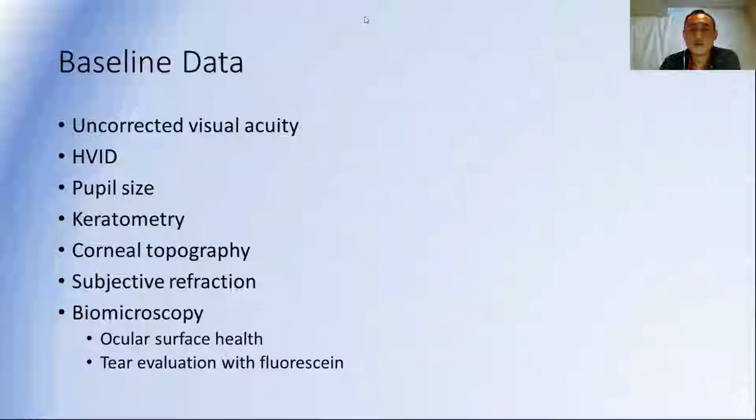All right, let's see. What is the reason for the low limit on astigmatism correction? I just mentioned that it doesn't correct as much astigmatism. It tends to correct maybe half of it. Even with the lenses that have toric peripheries or dual axis types of designs, they don't really correct more astigmatism necessarily. They just really help improve centration.